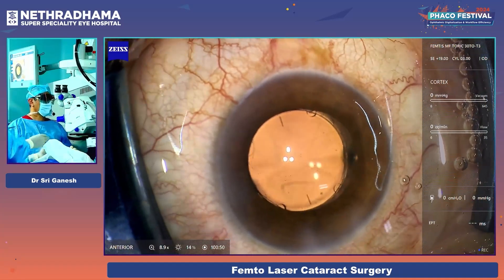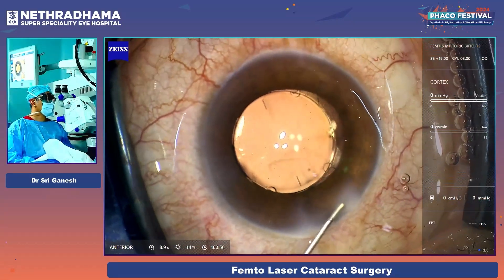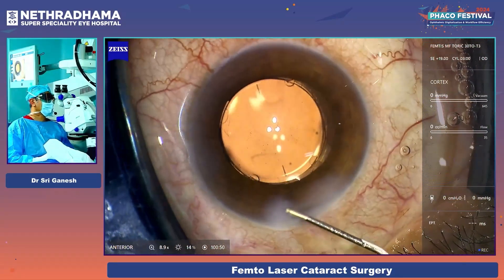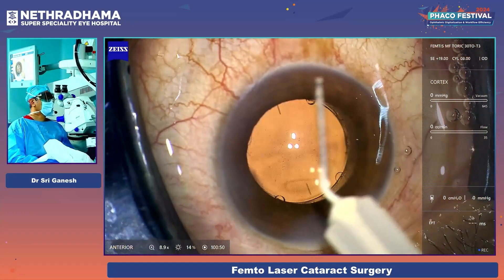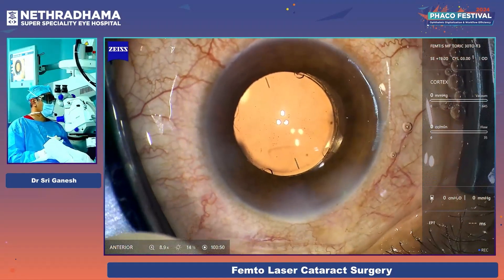I have evacuated the viscoelastic. You can see the lens is extremely stable — it does not move at all. This is the first implantation in live surgery of a FEMTIS MF in India. I have been using this lens recently and patient satisfaction is excellent.